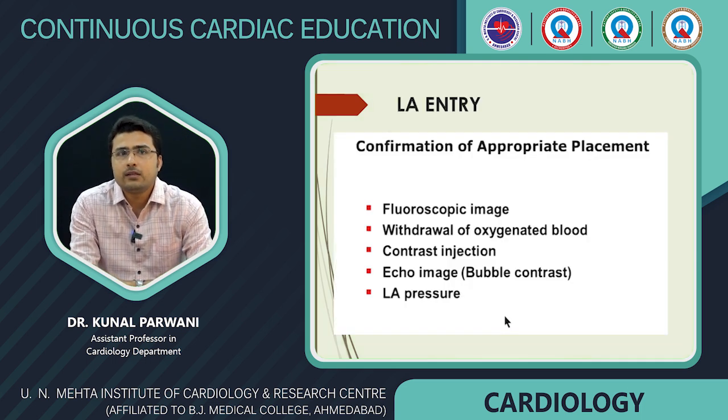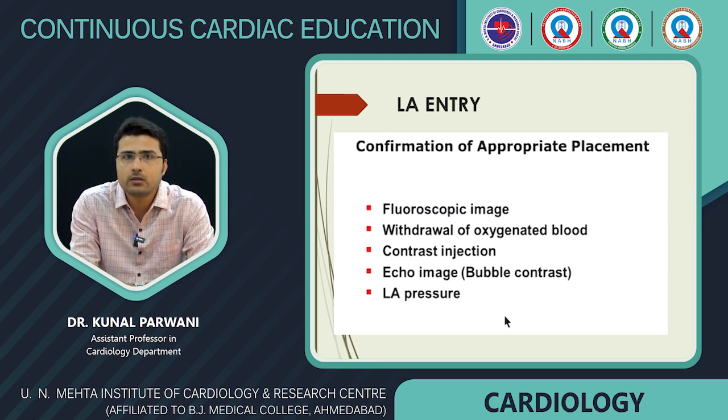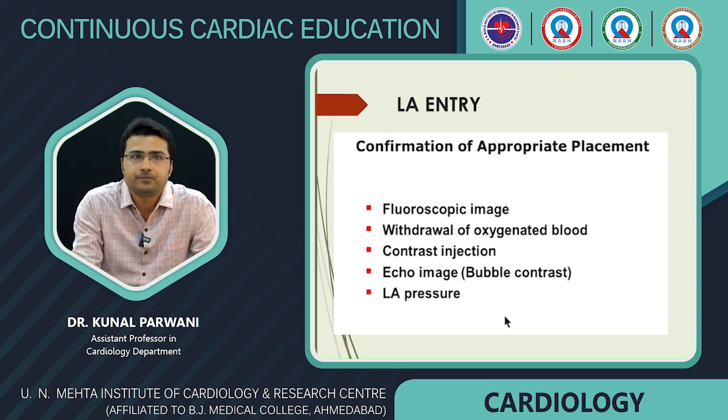There are certain things to confirm that our needle is in the LA or not. One is definitely the fluoroscopic image. Then there is withdrawal of the oxygenated blood, the contrast injection, and the LA pressure. These steps would help us to confirm that we are in the LA.